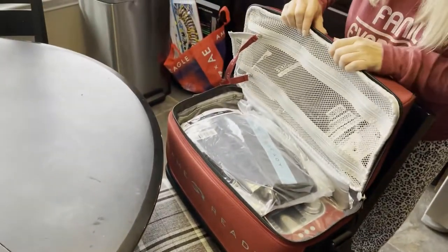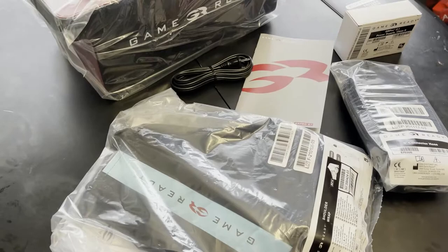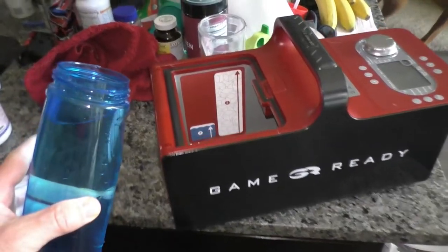You just received your Game Ready package and have unwrapped everything. Let's do a quick guide on how to operate this thing.